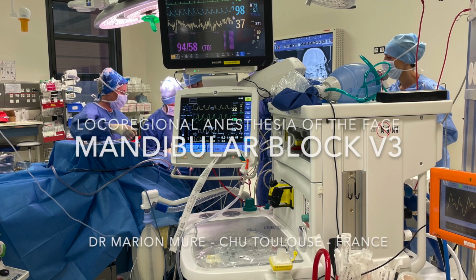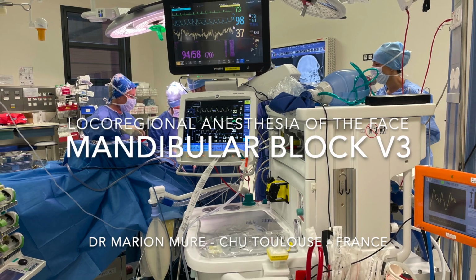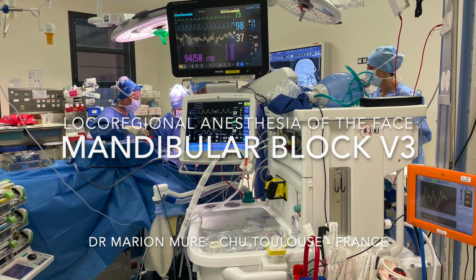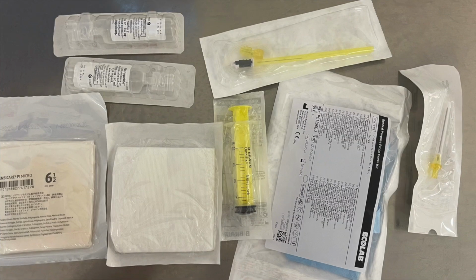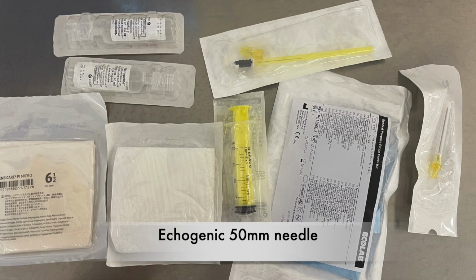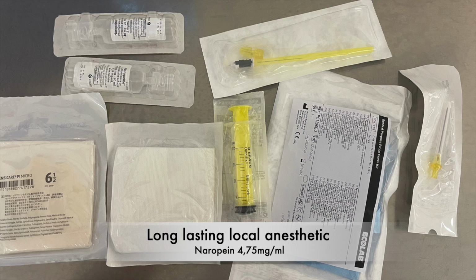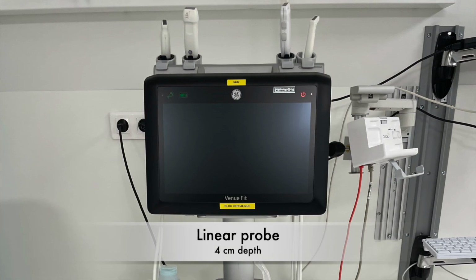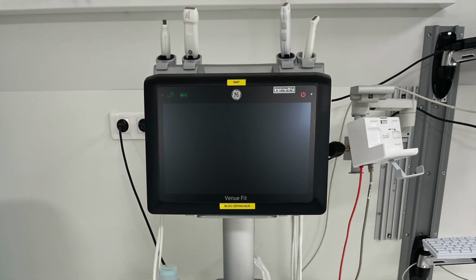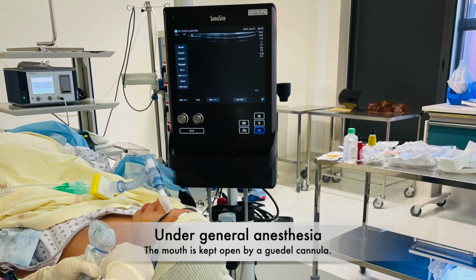In the facial locoregional anesthesia techniques, the mandibular block involves targeting the V3, the third branch of the trigeminal nerve. For specific equipment, a 50 mm echogenic needle and a long-acting local anesthetic, in this case narrowpin, potentialized by intravenous dexamethasone, are used. A linear probe with a depth setting of 4 cm is also employed. This ALR is performed under general anesthesia.